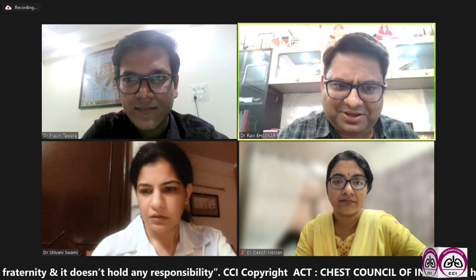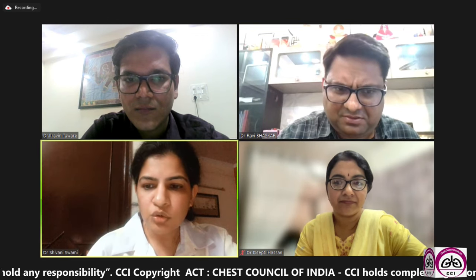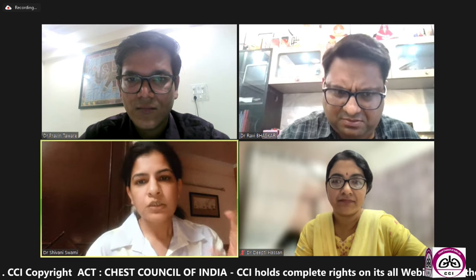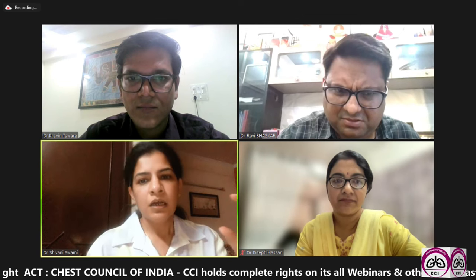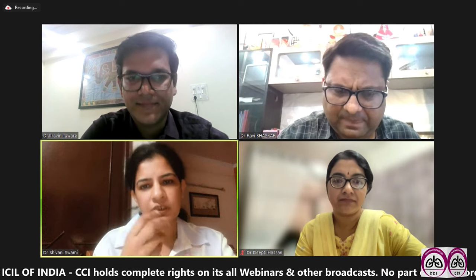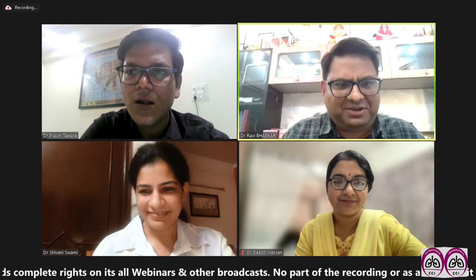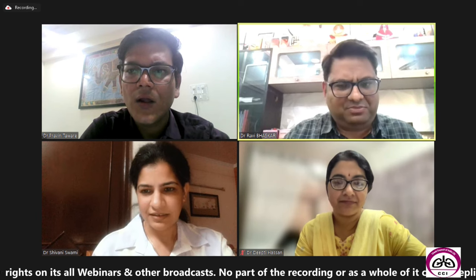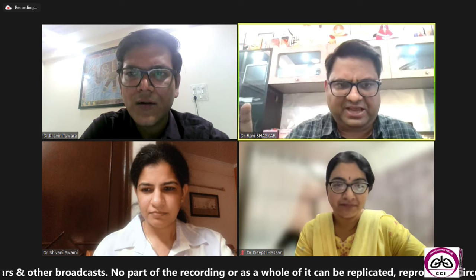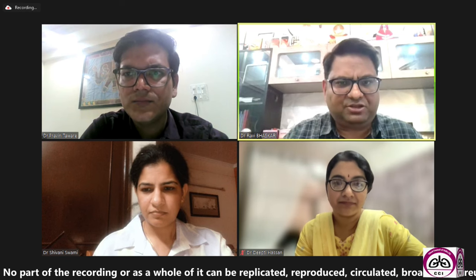I'm not getting the question. While using an MDI with the spacer? Whether you press the MDI first after connecting to the spacer, or you press it after you have put it in the patient's mouth. Okay, sorry, I was not getting the question. This has already been demonstrated in the video also. Generally we have to put it in the mouth, close the lips tightly, and then actuate the inhaler. And after 30 seconds, we can actuate the second dose.